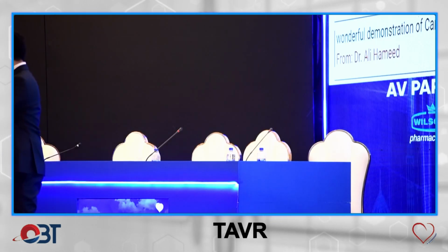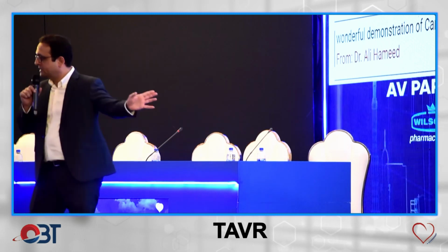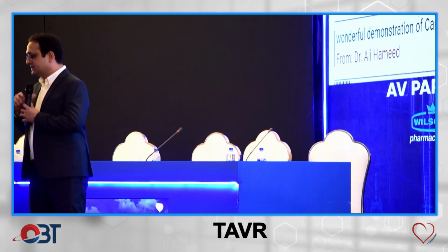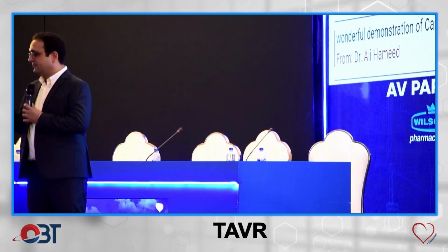Okay, so 3 points that I want to answer this with. First, sir, the average population in Pakistan is 67 years old, and this patient is already 62 and has multiple comorbids. Second issue is what data we have for TAVR versus surgical valves in terms of degeneration. What we know is that the gradients after 7 or 8 years are lower for TAVR valves than for surgical valves, for multiple reasons, as we get a bigger valve area and everything.